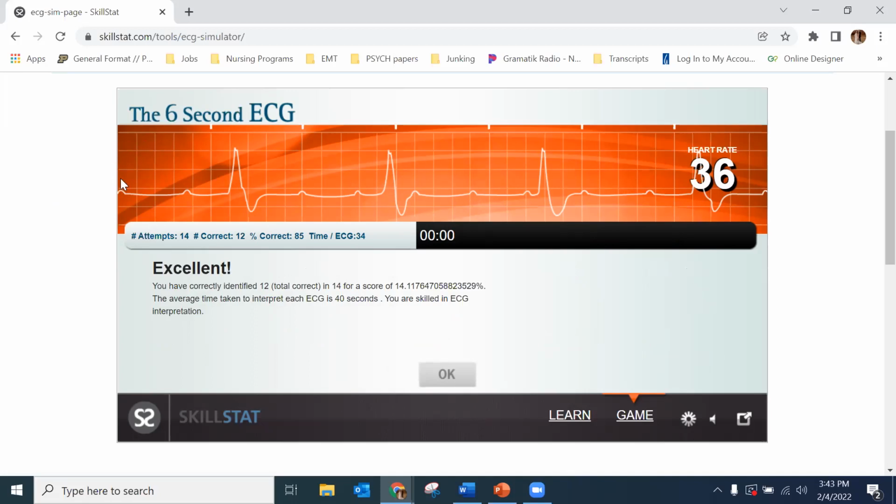There's something else going on. And if I go P to P wave right here, so that's what this little hump is, because they'll happen at the same time as your QRS. All my P waves march out and they're happy because my SA node's doing its job. Because signal didn't get to my ventricles, my Purkinje fibers fire 20 to 40. So I have these wide complexes, because anything that starts in the ventricles is a wide complex. These wide complexes are beating at roughly 36 beats a minute. So yeah, that's a third degree block.